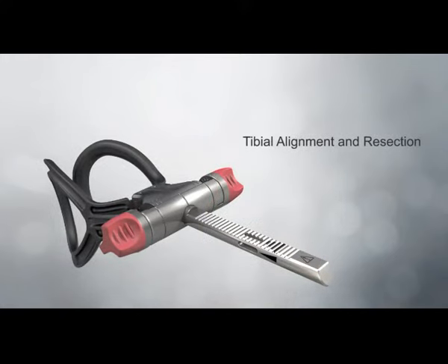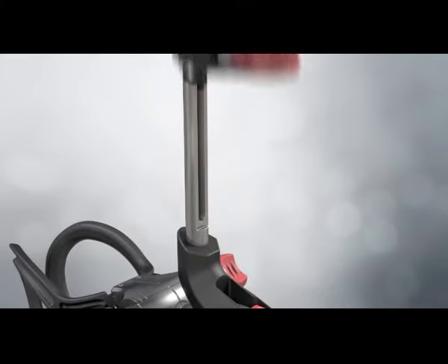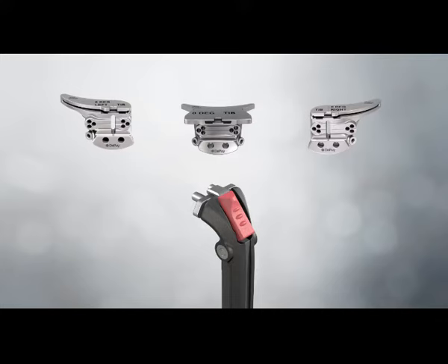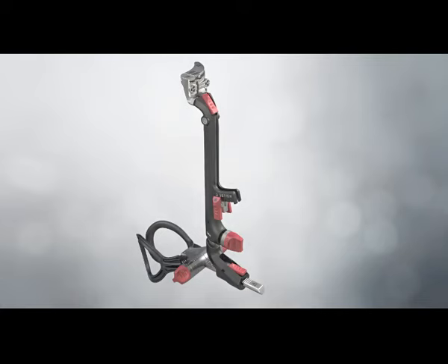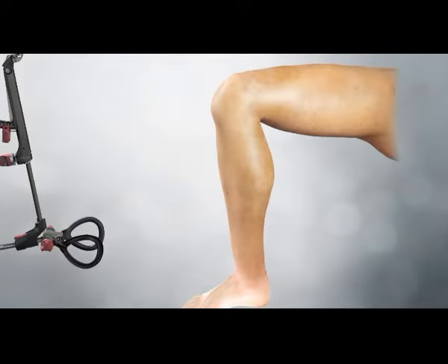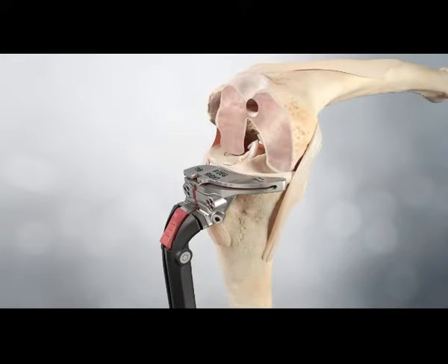Tibial alignment and resection. The tibial ankle clamp is attached to the distal uprod, then the distal uprod attaches to the proximal uprod with the height adjustment knob fully unscrewed. The appropriate cutting block is selected and attached to the proximal uprod. The desired tibial posterior slope is set prior to attaching to the leg using the two pinch levers on the slope adjustment. With the knee in 90 degrees of flexion, the ankle clamp is placed around the malleoli. Varus valgus is initially set by aligning the proximal central marking on the cutting block with the medial one-third of the tibial tubercle.